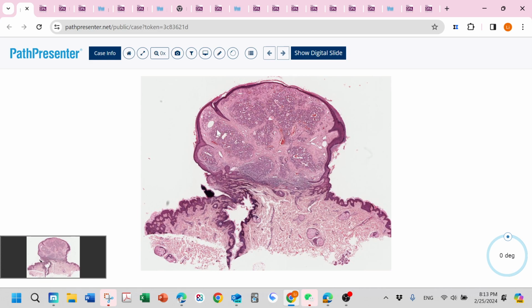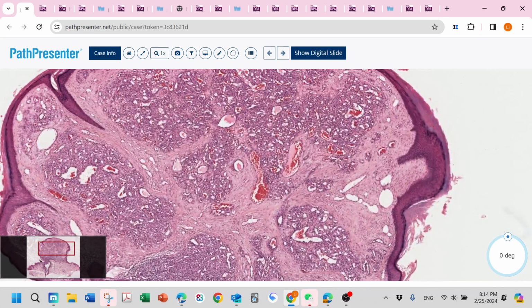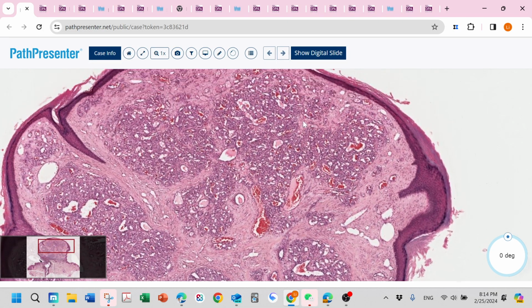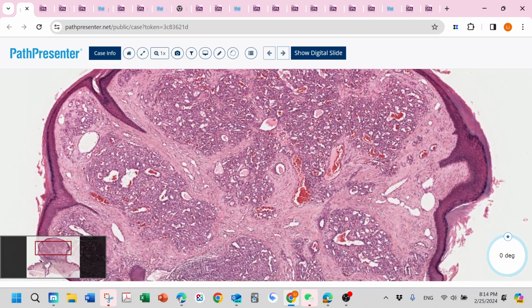Lobular, all of these endothelial cells, this vessel forming this lobular, 1 lobular, 2 lobular, 3 lobular. Then capillary means most of the vessels should be small, thin wall vessels, and usually you will see one big vessel and then a lot of small vessels just around it, like small vessels trying to fit this big vessel. Big vessel, small vessels around, forming this lobular. This one also again, big vessel, small vessels around.